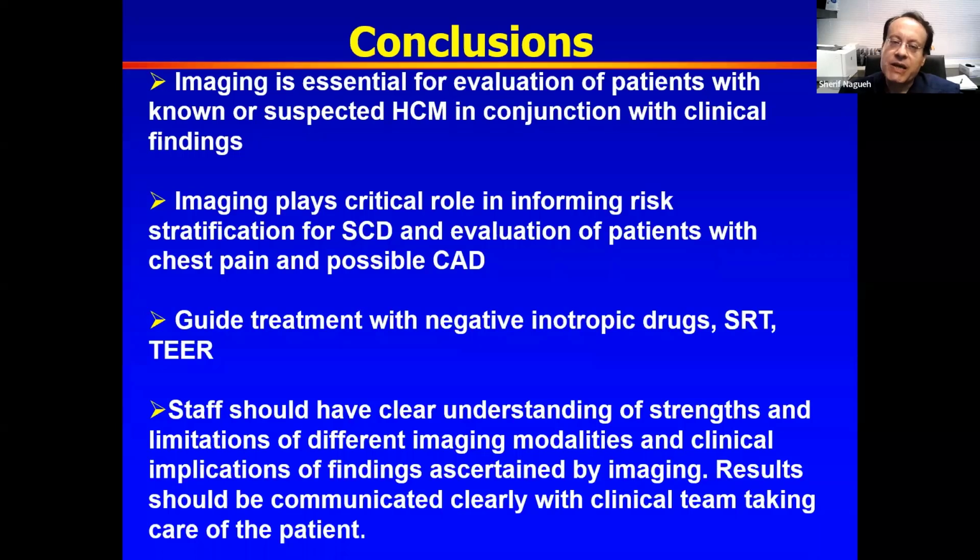In some cases, the approach is not just a myectomy, but plication of the anterior leaflet of the mitral valve is essential, and the surgeon should know that because that will alter their approach.